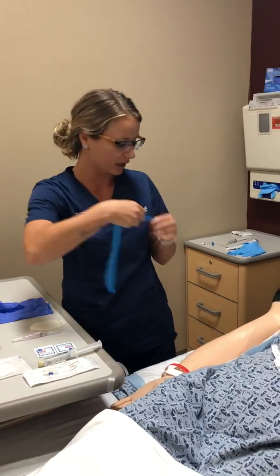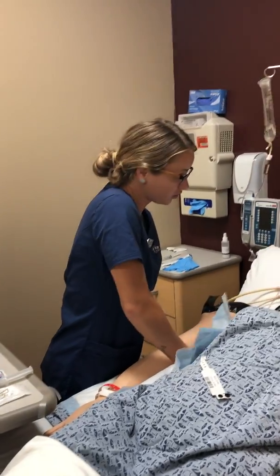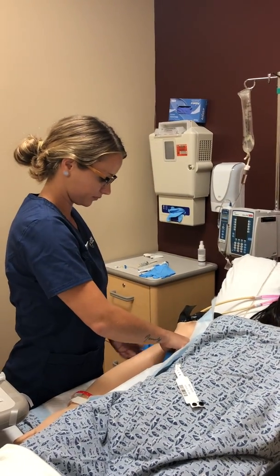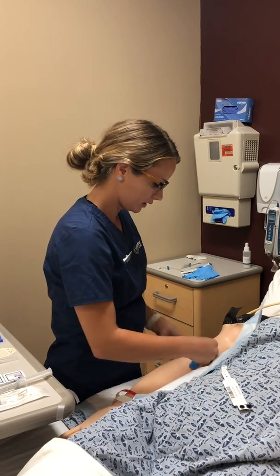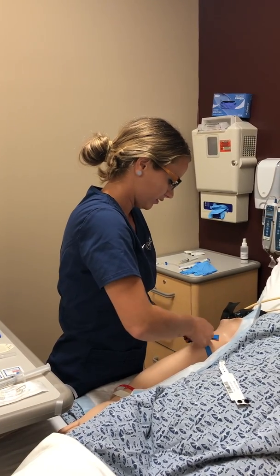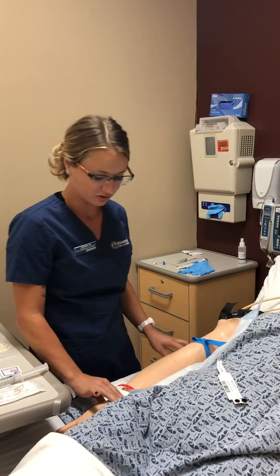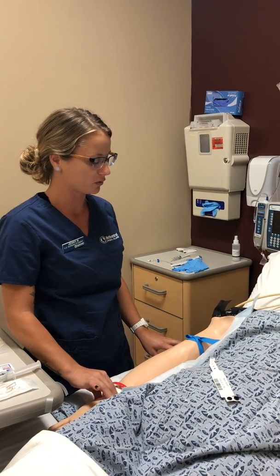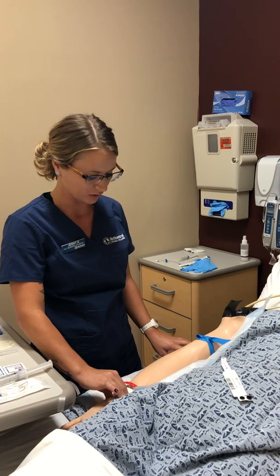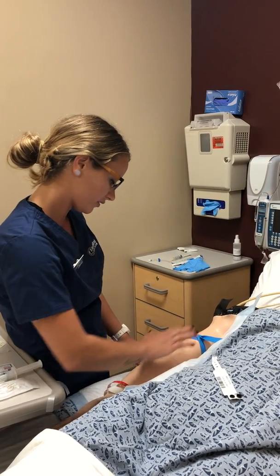So first, I just want to kind of see what veins we're working with. So I'm just going to place this tourniquet around your arm. And I'll just apply this briefly. I just want to kind of see what your veins look like. I'm going to apply it snug, but not too tight. I'll check radial pulse. I don't want to occlude the arterial blood flow, and I feel a radial pulse, which is good. So a way to assess is just kind of visualize.